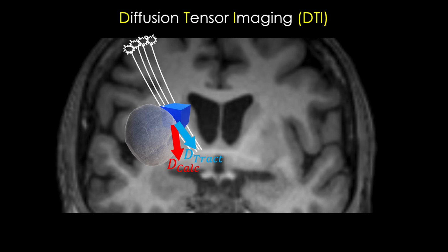You've got a brain tumor and they're going to be resecting it as close as they can to these really important neurons that control your movement. Is a rough estimate good enough, or do you want to get as close as you possibly can to the true location and direction of these? I would want the latter.